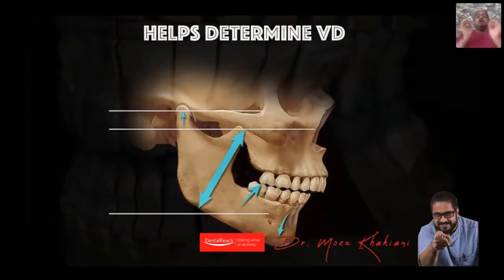It's become class 1. More importantly, friends, can you see there's automatically space that is available in the anteriors for me to build teeth into? My technician can easily do a wax up here without opening the bite. Try and understand, we're talking about reconstructing the entire dentition without increasing the vertical dimension, which means we are not encroaching into the patient's freeway space. So freeway space will still be present. All we've done is we've deprogrammed the mandible and nature automatically provides me with the space that I desire in a lot of my cases.